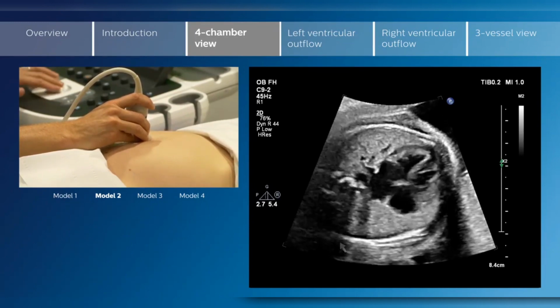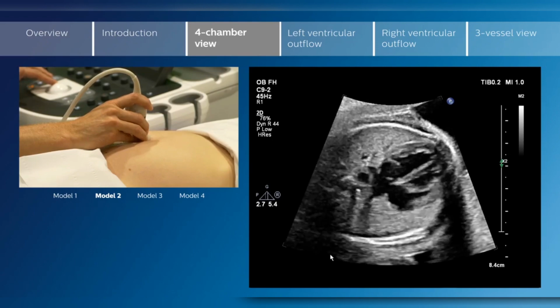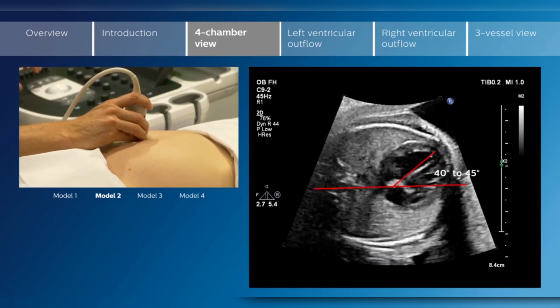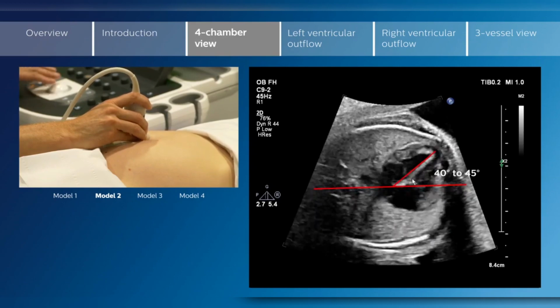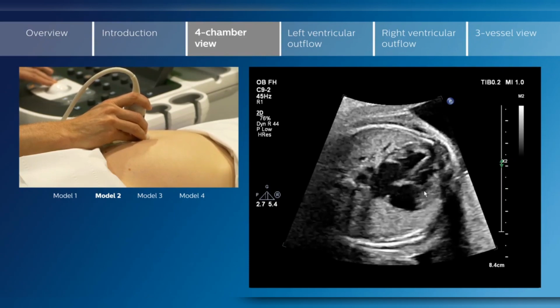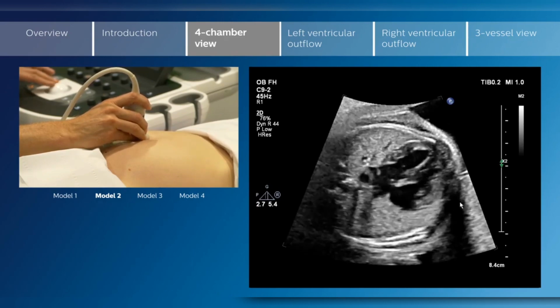When we look initially here at the size of the fetal heart, we can see that the fetal heart occupies about 1/3 of the area of the thorax, and that the apex of the heart is pointed anterior and leftwards. We should see that the left and right hand sides of the heart are symmetrical. In order to work out which is left and right, then clearly the position of the apex of the heart needs to be worked out once during the examination.